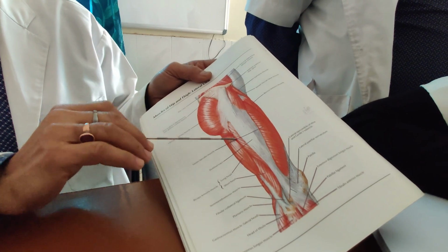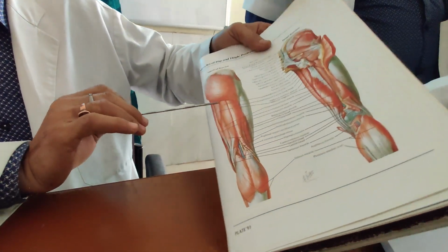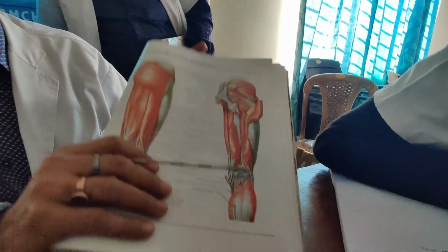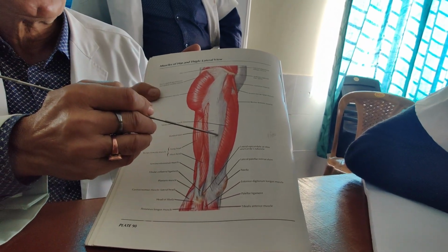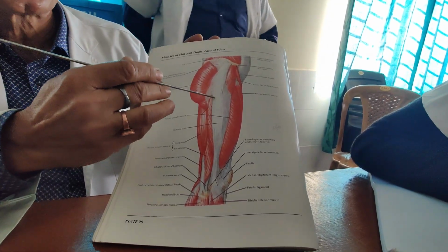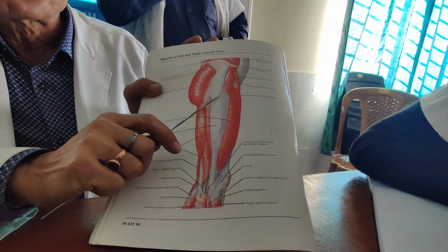What next is coming? Vastus lateralis. Now with the vastus lateralis, two things you can do. Sometimes people give an incision like this, so as to directly hit the bone. But while doing so, you essentially cut certain vessels also. So you have to cauterize them here and control them, because externally your ring is somewhere here.